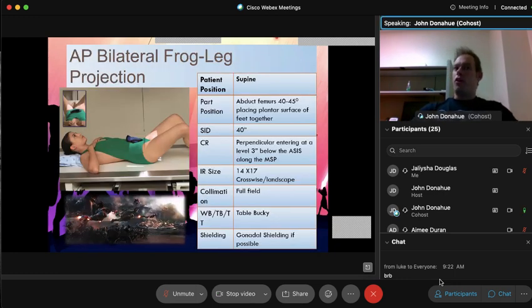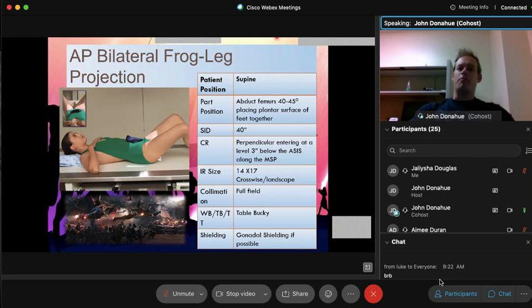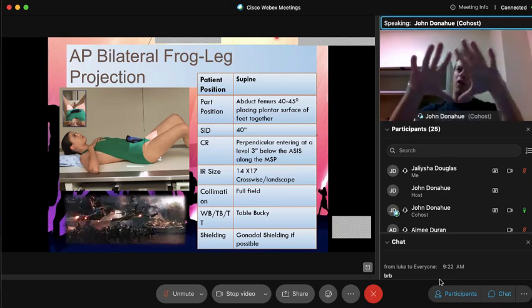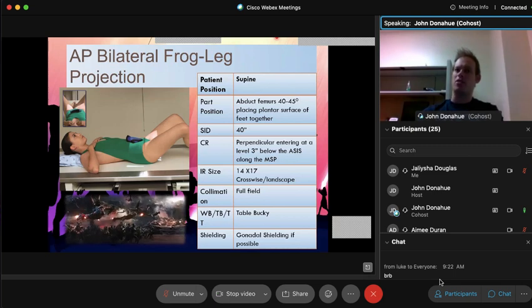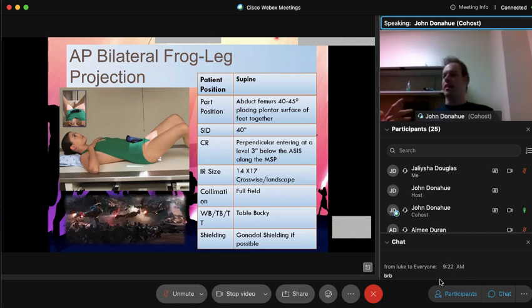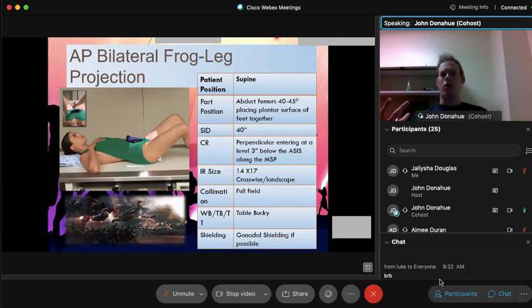Okay, so when they do call for a lateral exam on a pelvis, that's going to be what we call the AP, bilateral frog leg. We are going to frog leg both legs. That's why it's called bilateral. Now, they are still going to be in the AP supine position, same as that pelvis. We're not ever going to do the standing up. It must be done on the table only, in the supine position only.